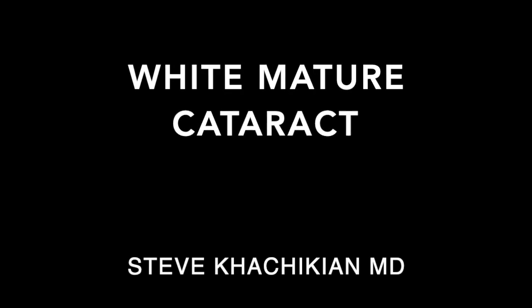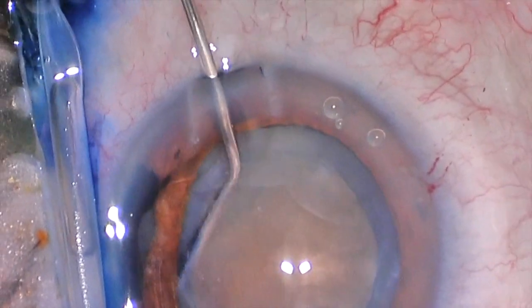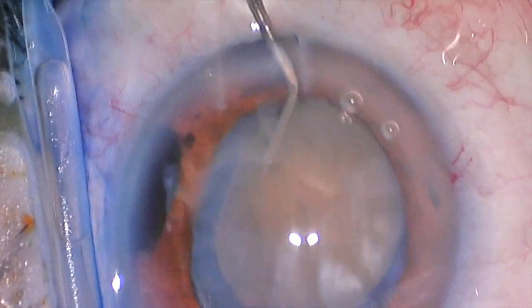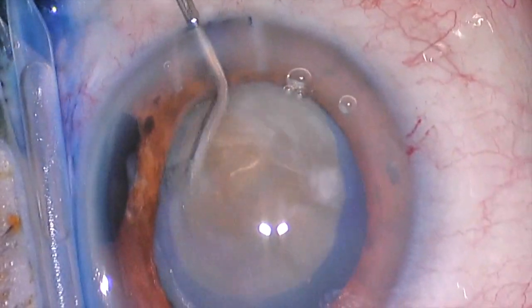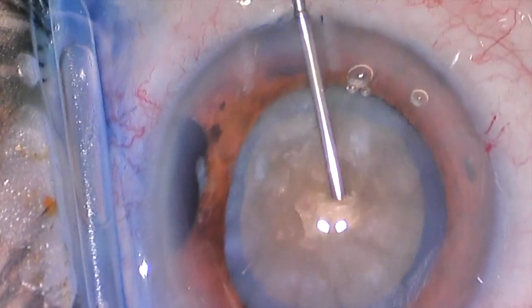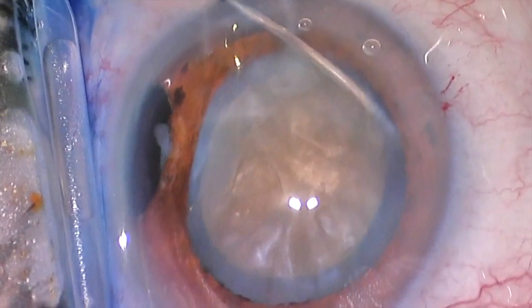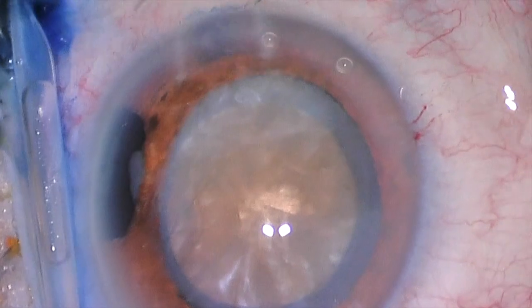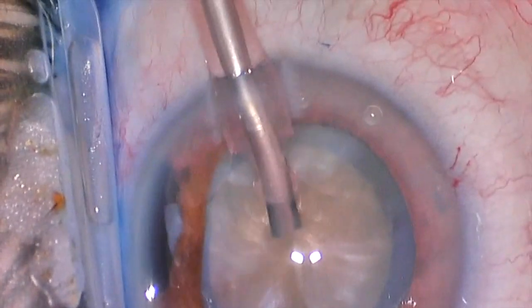Hello everybody. This is Dr. Steve Kachikian again from the Black Hills Regional Eye Institute. Today I'm showing a more difficult or more complex case of what we call white mature cataract. What you can see we're doing here is rotating that lens. We have already made our incisions, inflated the eye with viscoelastic, and stained the anterior capsule with TriPan Blue for better visualization. Now we're rotating the lens, trying to sandwich it in that viscoelastic or gel material, which helps hold space inside the eye.